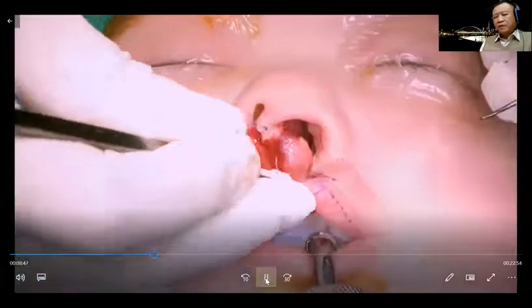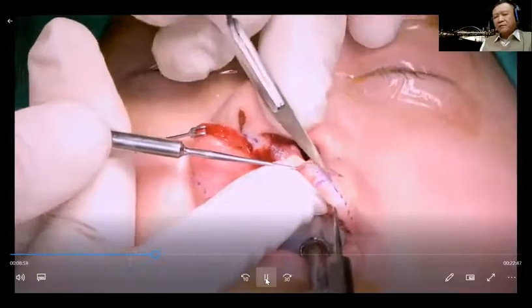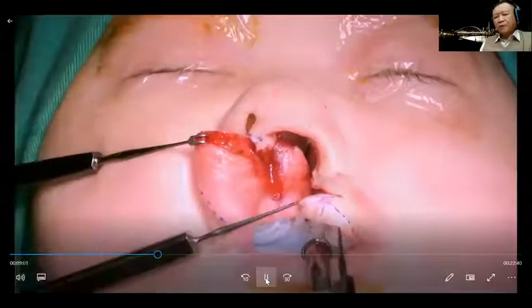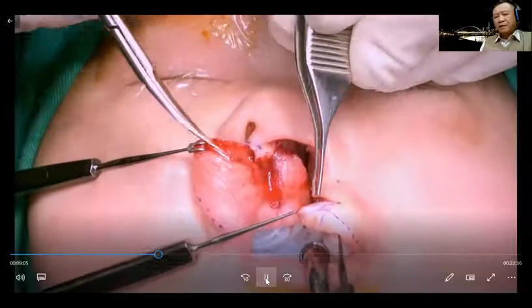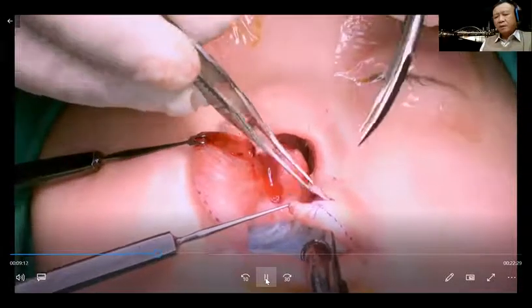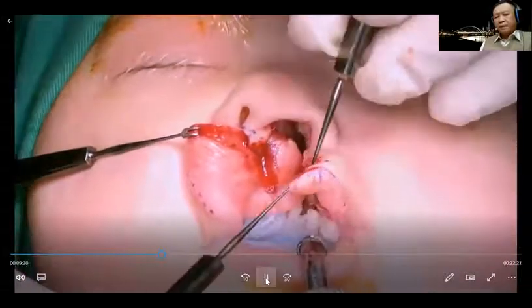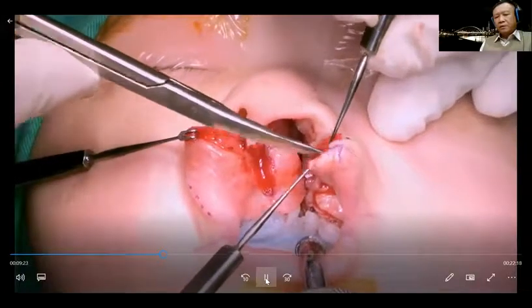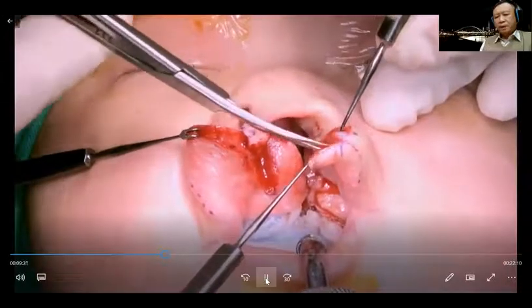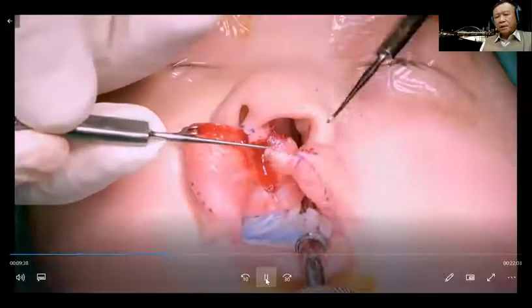And then after this dissection, I start to cut the vermilion flap. Again, under traction, you can see a very good triangular vermilion flap there. And you use an 11 blade to cut the triangular flap and then cut the excess lip mucosa, and keep some of the marginalis muscle in the triangular flap so that you can increase the volume for the vermilion fullness. Now, another part, use sharp scissor to remove the mucosa and preserve the triangular vermilion flap.